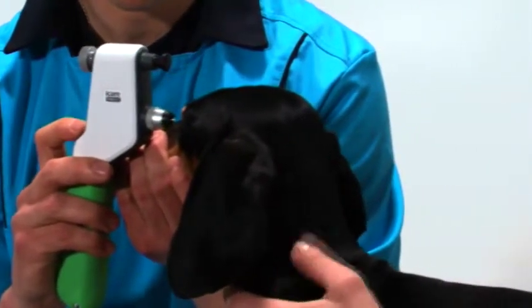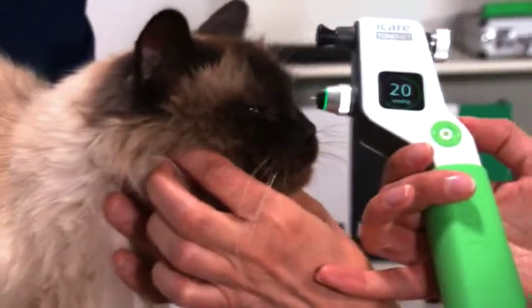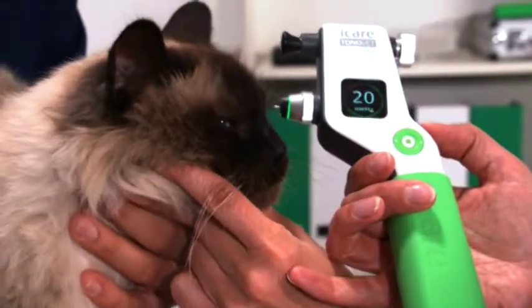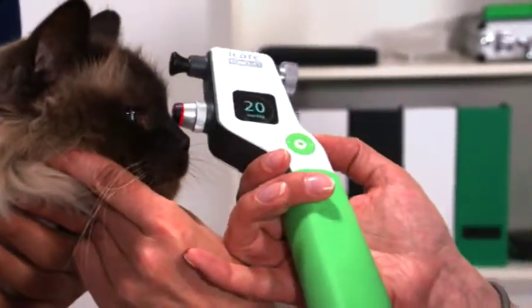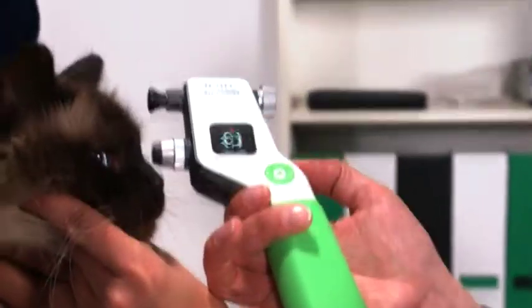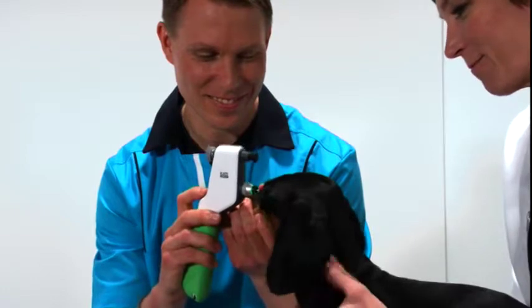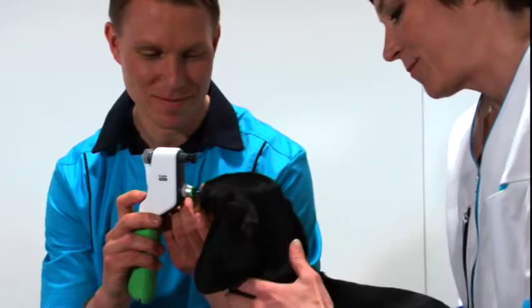A green light indicates that you are good to measure. A red light, on the other hand, indicates that you need to stop and reposition the device correctly at a 90 degree angle to the eye and parallel to the floor. These indicator lights also create a reflected ring on the eye, which helps you to aim at the center of the cornea.